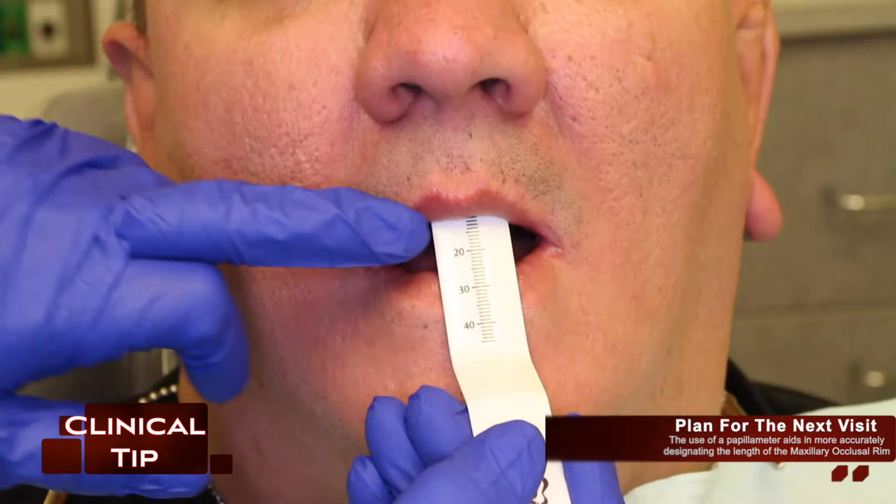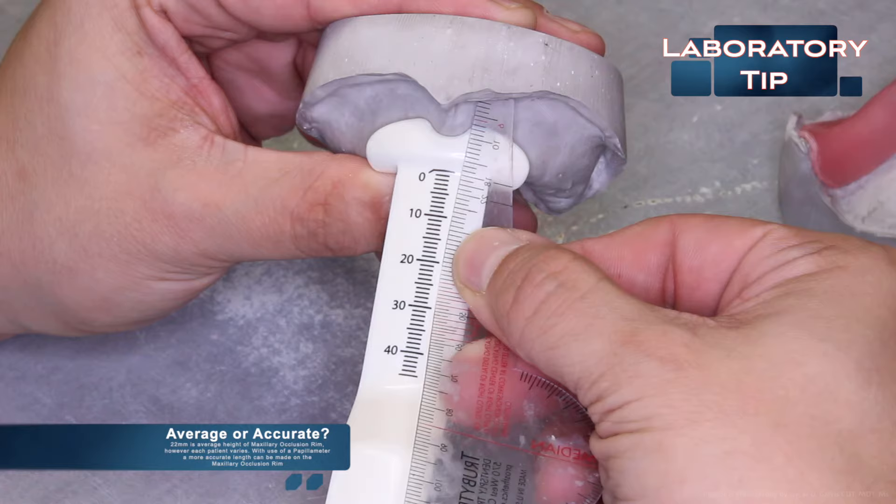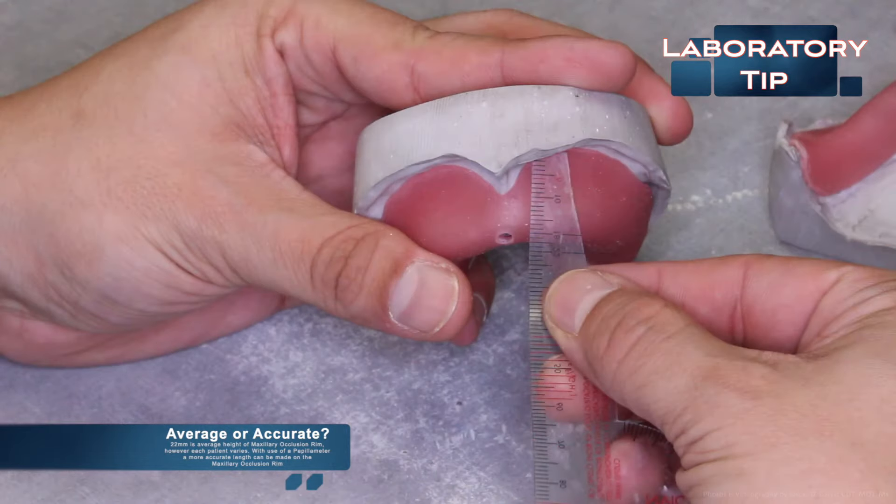In a previous video we spoke about planning for the next appointment. The use of a papillometer aids in more accurately designing the length of a maxillary occlusion rim. The question is whether we should use averages or be more accurate. Twenty-two millimeters is the average height of a maxillary occlusal rim in the anterior region; however, every patient varies. With the use of a papillometer, for this patient we have designated a length of 27 millimeters, which is quite a difference from the average 22.